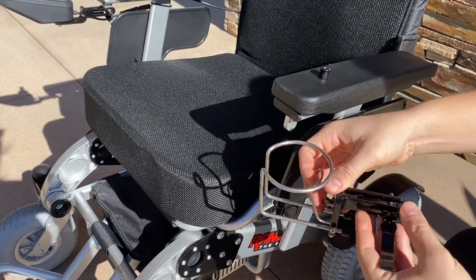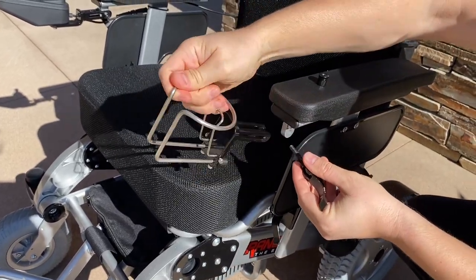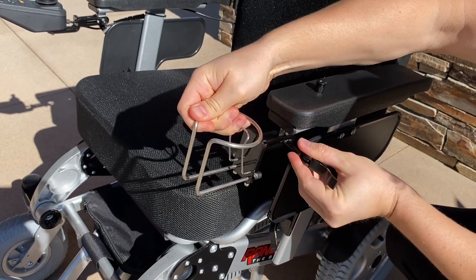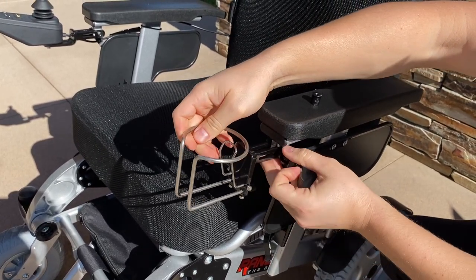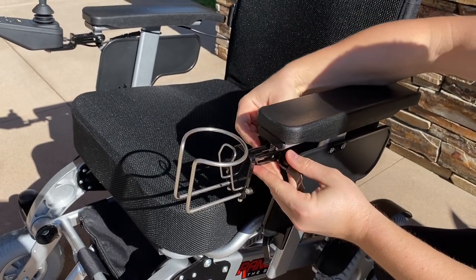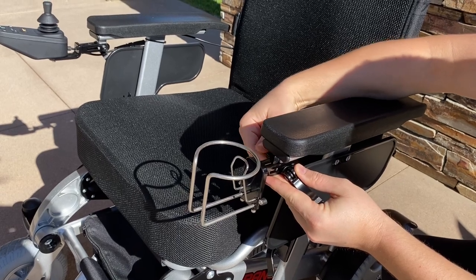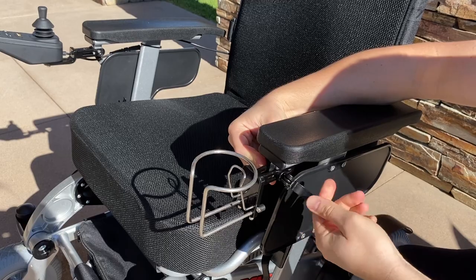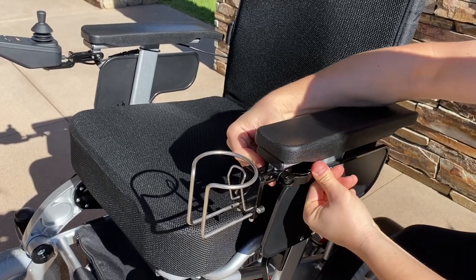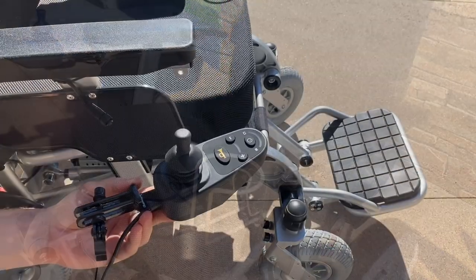To install the cup holder, unscrew the little knob, take out the screw piece, line up the holes of the cup holder with the chair hole, insert the screw piece, and screw the knob onto the end of the screw piece coming out the other side. Make sure it's nice and tight, then twist the little black clamp and close it up to lock it into place.